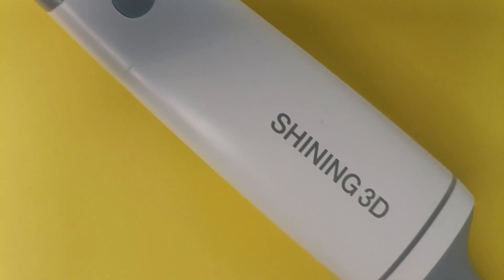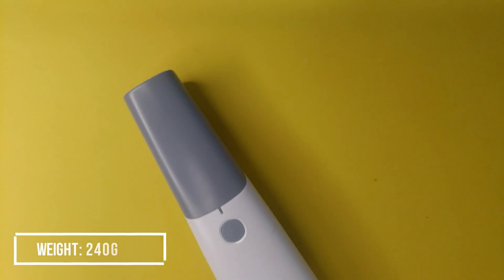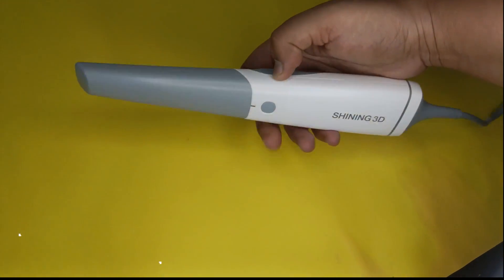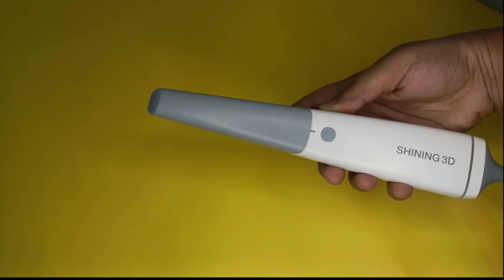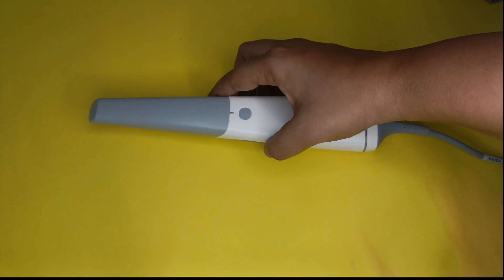This is our intraoral scanner by Shining 3D. It is ergonomically designed for optimal handheld operation. I have tried scanners from two or three different companies, but I really like the shape, the weight — which is around 240 grams — and the grip. It feels really right in my hand. The tip of this scanner can be autoclaved a hundred times, it has automatic anti-fogging, and it has one-button control and motion sensing control. With a wide range of intelligent functions, this scanner guarantees a more comfortable chairside experience and efficient clinic-lab collaboration.